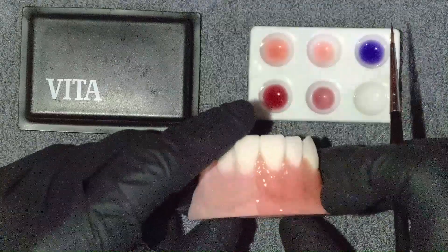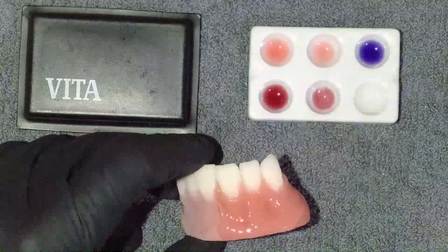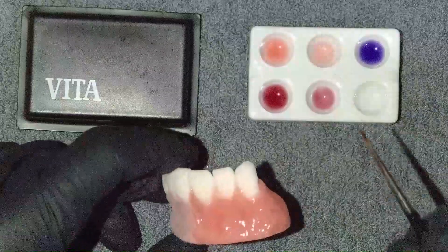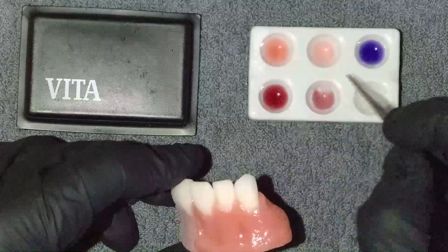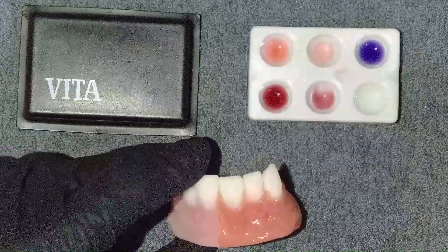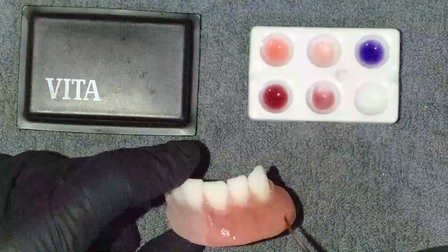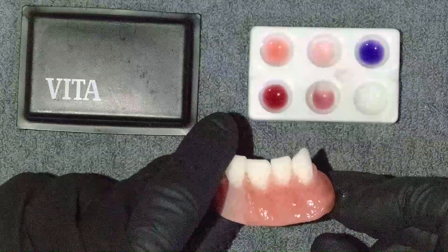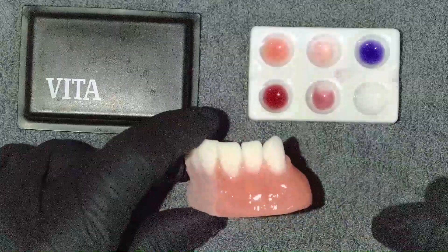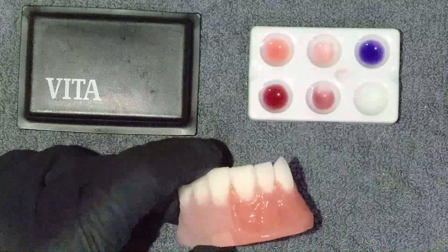It goes down really quick and it's very subtle, but it makes a big difference. I can also use a little bit of pink around the teeth, and mix the two a little bit to get a little darker. I'm also going to use a little bit of purple lightly down at the bottom. You can see that leaving it wet and adding those colors, we can do a very quick gingival characterization. It's great for something that's quick and very subtle — that's Axel's technique.